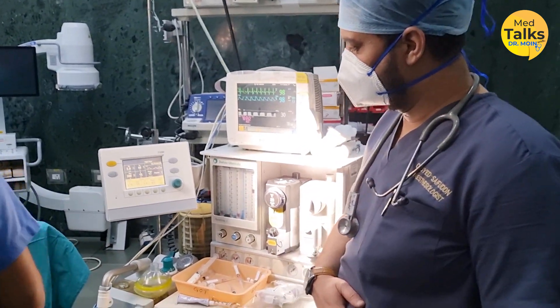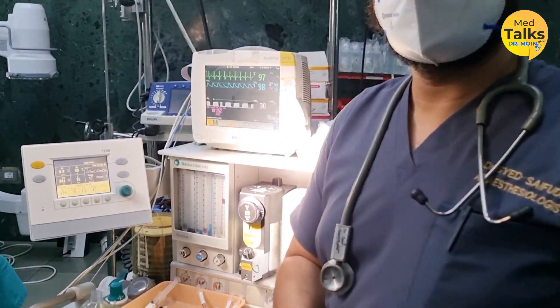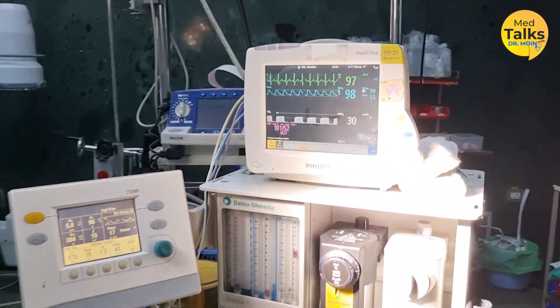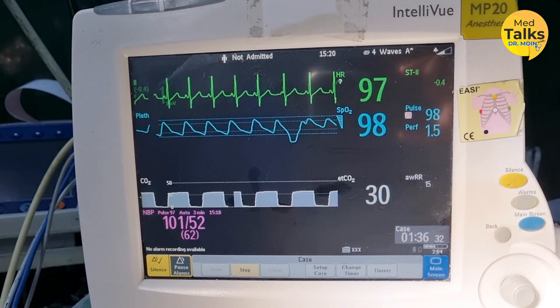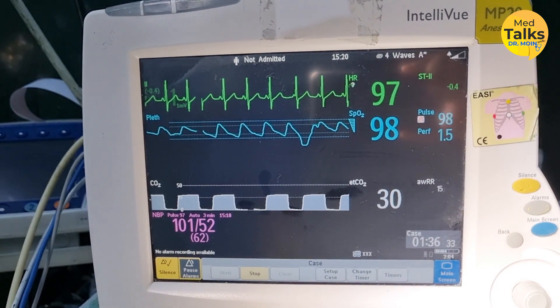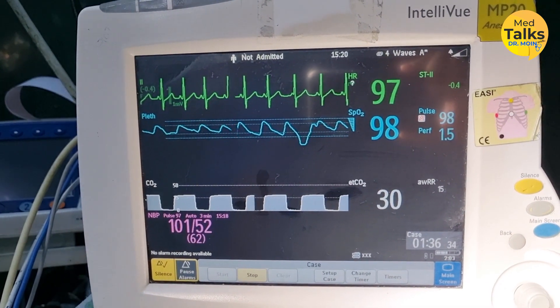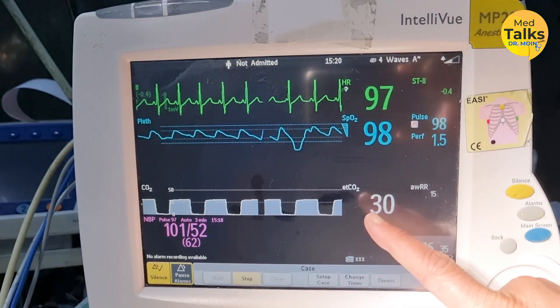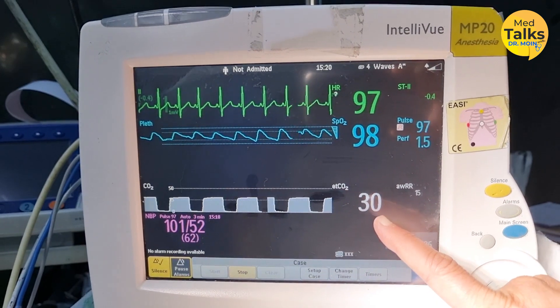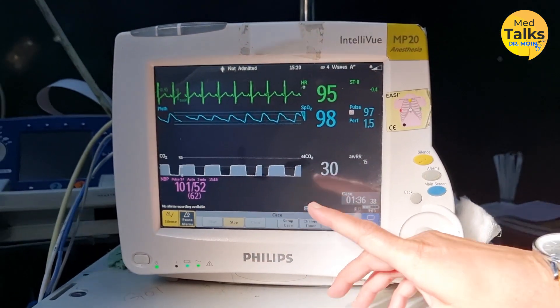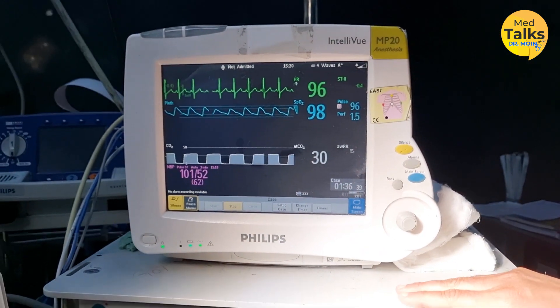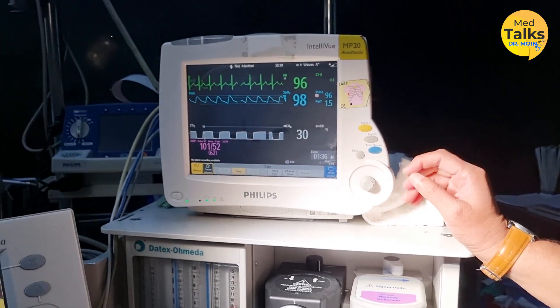Meanwhile, we will be monitoring all these parameters, like the heart rate, saturations, EtCO2 — the end-tidal carbon dioxide — and the blood pressure. Everything will be measured in this monitor.